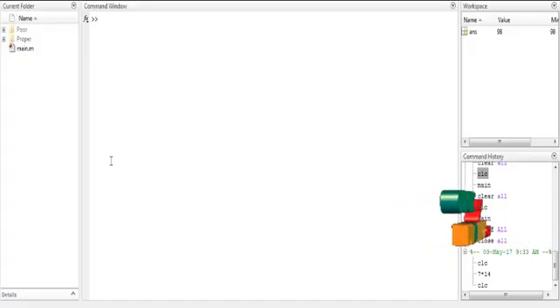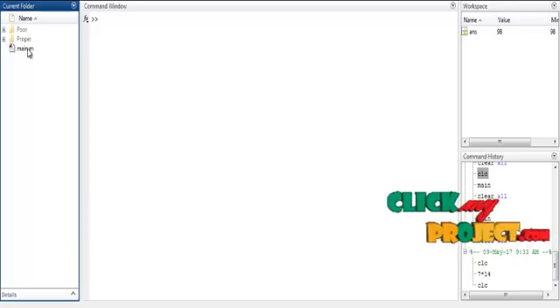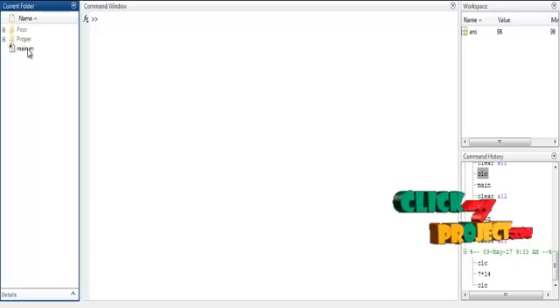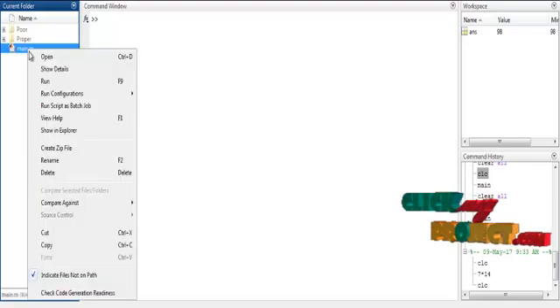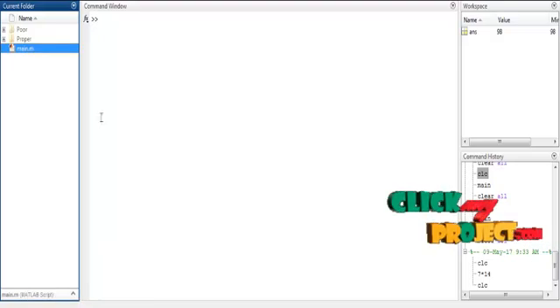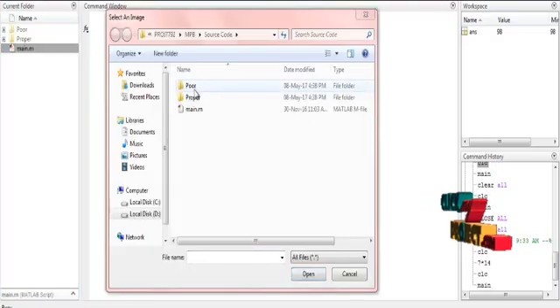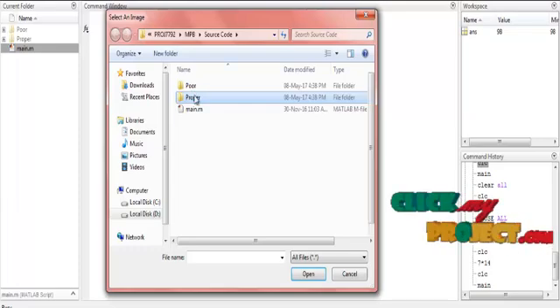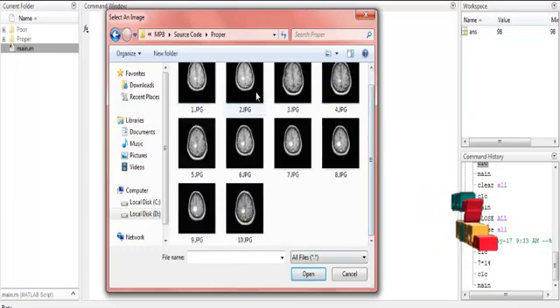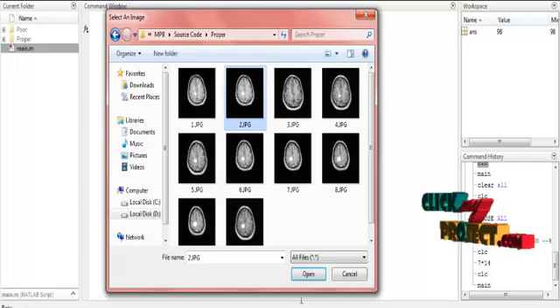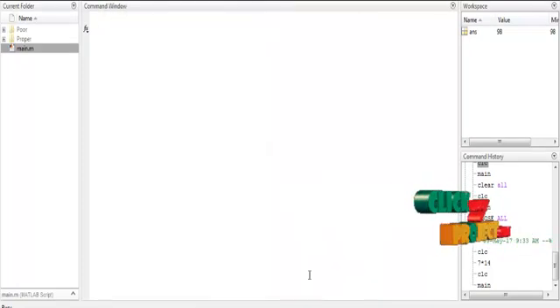Now let us discuss the running procedure. Click the main file — it takes some time to run. Click the main file and then run. I will click to load the proper image. Here I will select one type of image; I will select the second image and then click Open. It will be displayed like that.